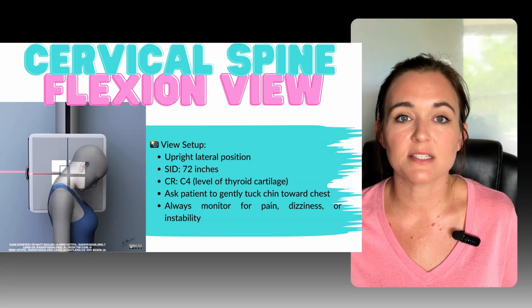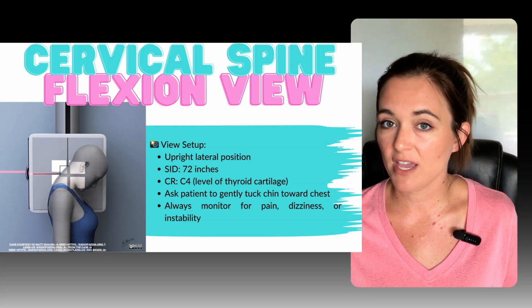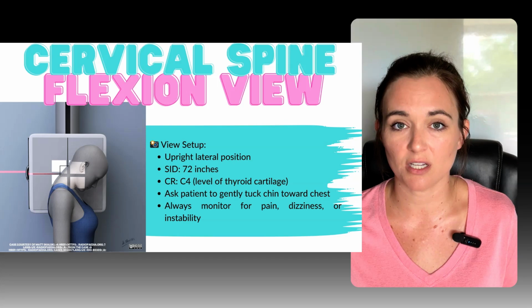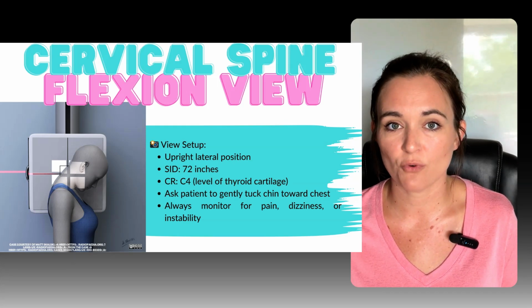Now here's what makes it different. You're going to have the patient slowly bring their chin towards their chest. Not a fast movement, not jerky, just a slow, gentle tuck of the chin like they're trying to look down at their own chest. Now, as the tech, you've got a few important jobs to watch for here.